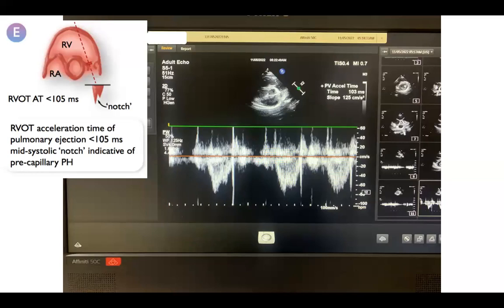I placed a continuous wave over the pulmonary valve, but there was no pulmonary regurgitant jet, so I couldn't measure the peak pulmonary regurgitant velocity or the late end-diastolic pulmonary regurgitant velocity to calculate the mean or diastolic pulmonary artery pressure. However, this was the first positive sign suggestive of pulmonary hypertension in this case: the acceleration time is 103 ms, which is less than 105.